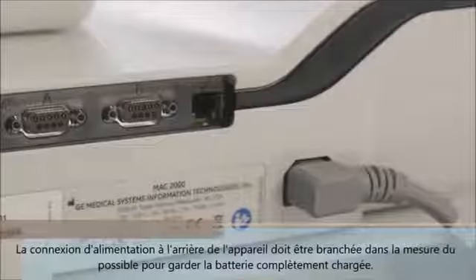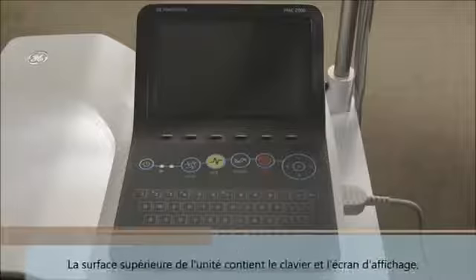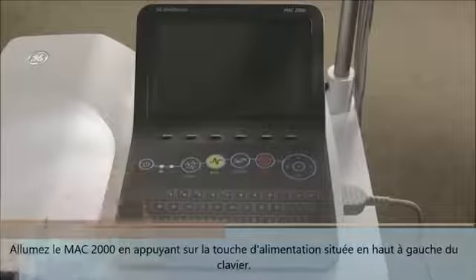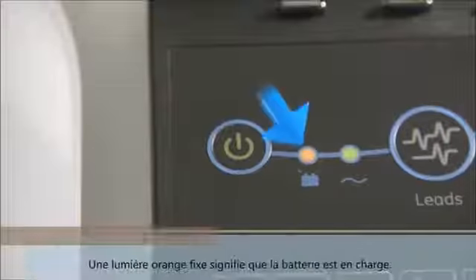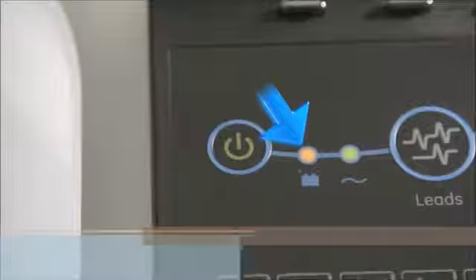The power connection at the back of the unit should be plugged in whenever possible to keep the unit's battery fully charged. The top surface of the unit contains the keyboard and display screen. Turn the MAC 2000 on by pressing the power key on the upper left side of the keyboard. Next to the power key, you will see the battery LED. A solid amber light means the battery is charging. If the light is flashing, it indicates the battery is low.